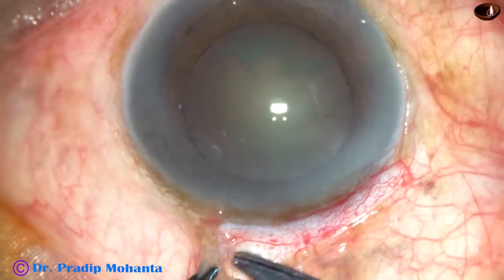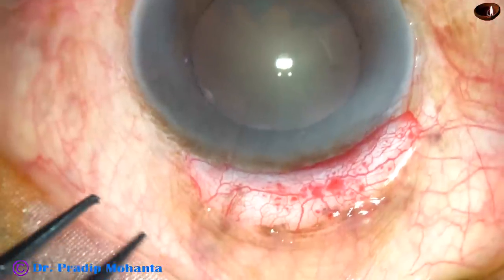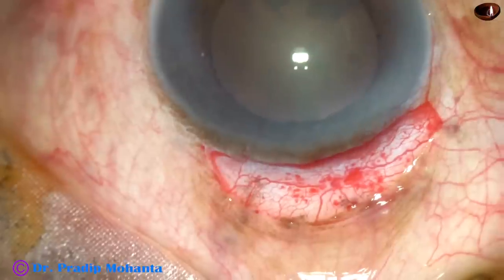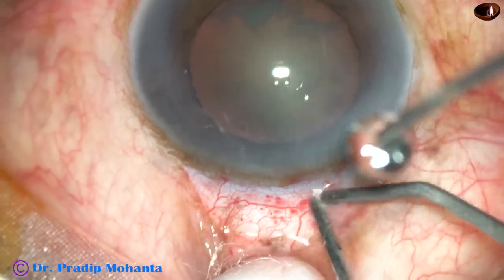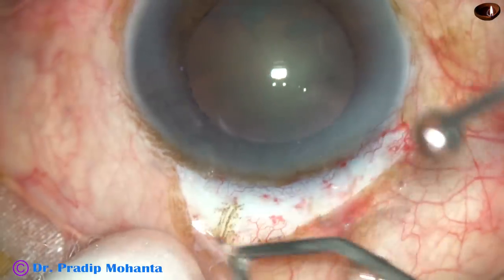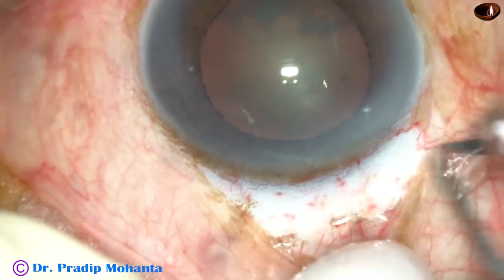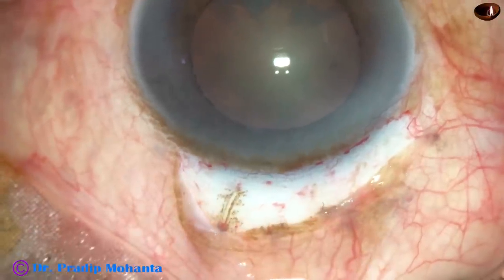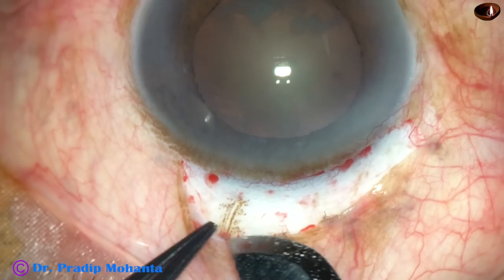Now, very mild wet field cautery is to be done. This step can be avoided by seniors who have done many SICS. Just touch over the blood vessels and lift the wet field cautery. Don't cause any charring of the sclera — the sclera should not contract.